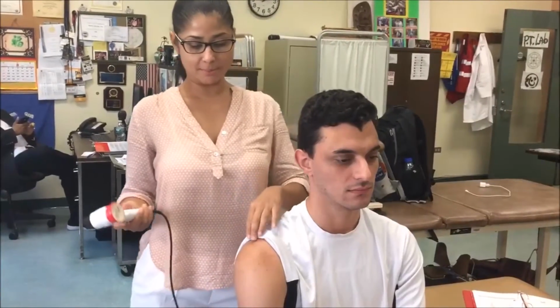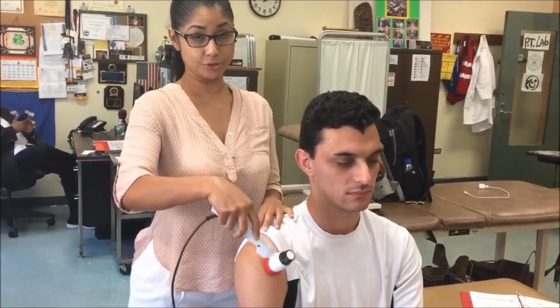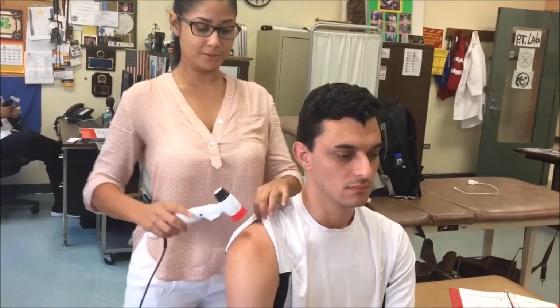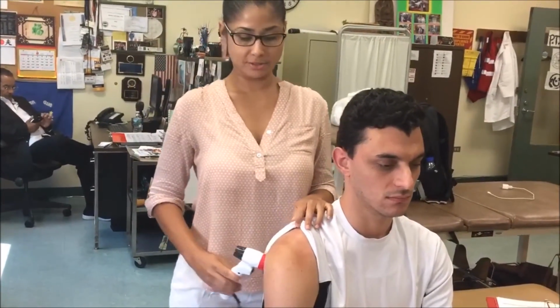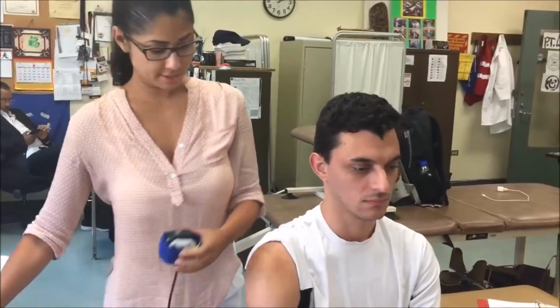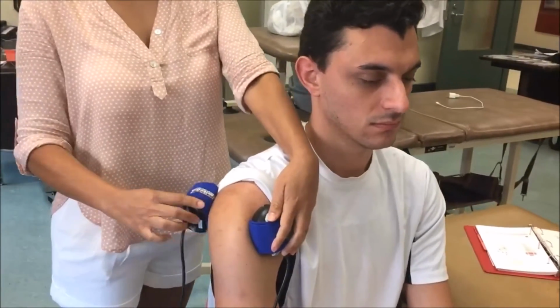Shoulder. For frozen joint and impingement, you place the laser all around the shoulder joint, surround the supraspinatus, anterior, posterior, and you can also put one SLD here and another one posterior.